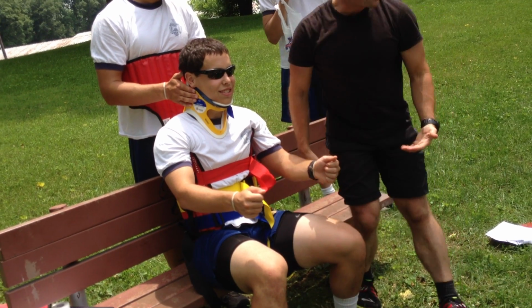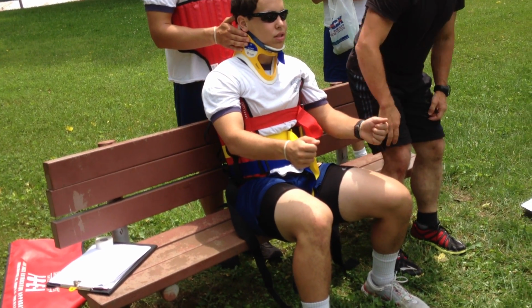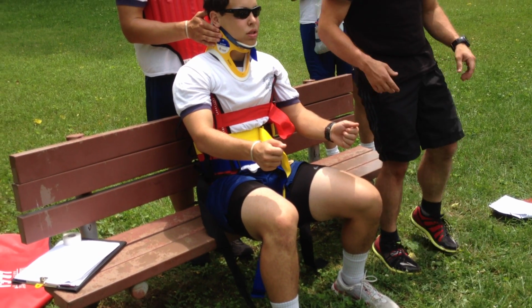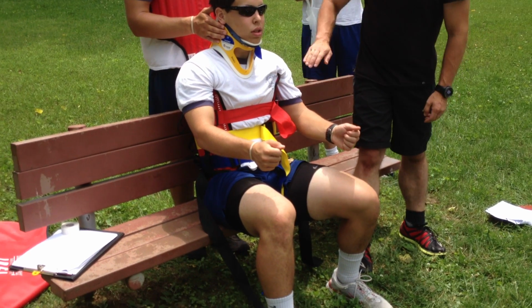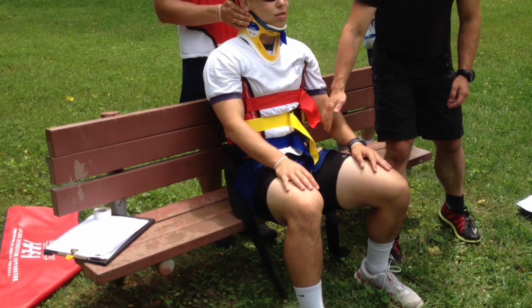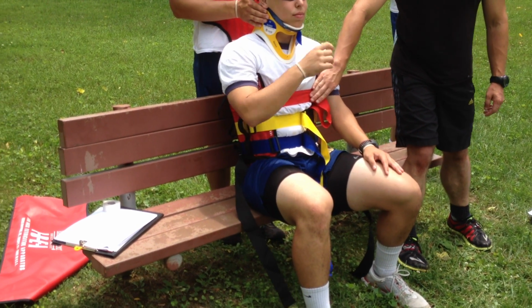Alright. Now that's going to actually help lift the legs. If I'm lazy and have the legs way out here, it looks okay, but there's going to be so much slack that the legs will just flop around, and that's no good. So, bottom and the middle straps are tight. Leg straps are tight. Chest strap is still loose so the patient can breathe.